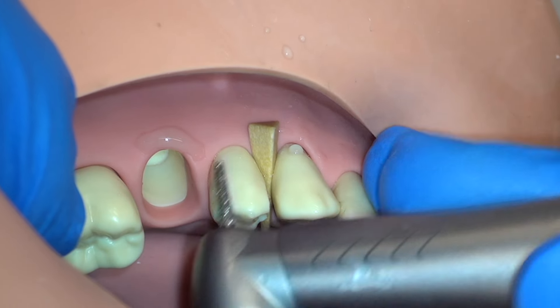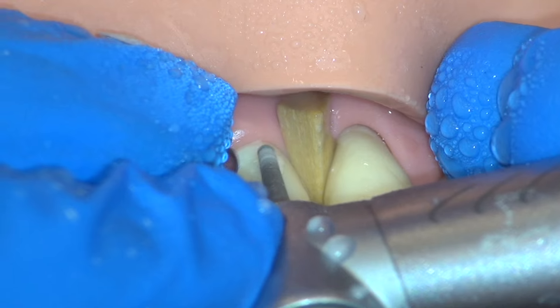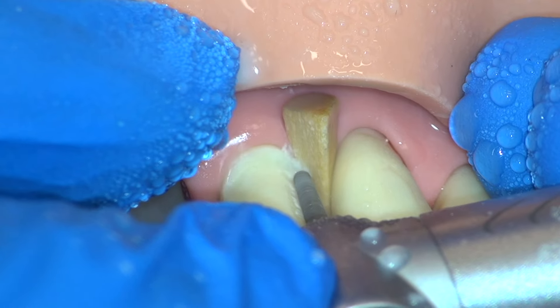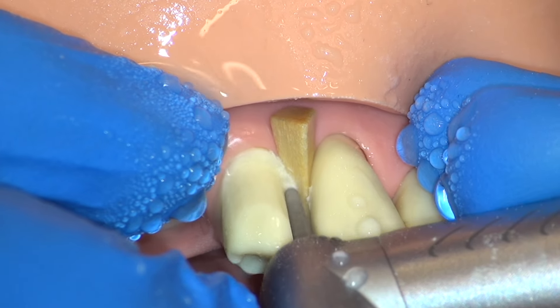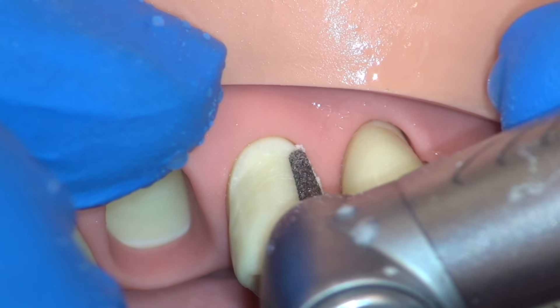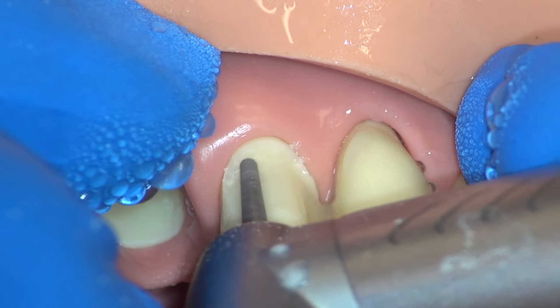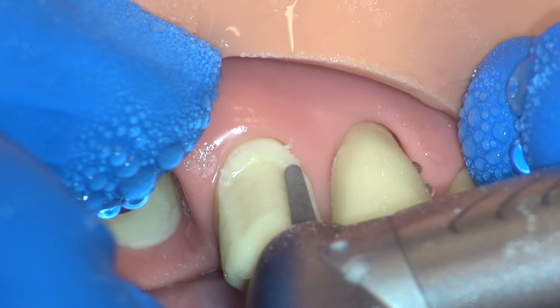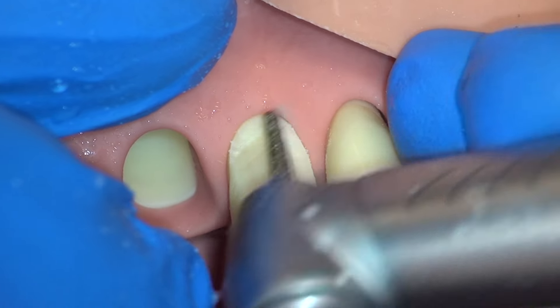Next, I use the green mod shoulder burr to begin the bulk of our reduction for the facial areas of the premolar, which will have porcelain. For these areas, the finish line needs to be a 1.2 millimeter depth, keeping in mind that the tip of the burr is one millimeter. Work sequentially from one side of the tooth to the other in a controlled manner, and bring this reduction through the proximal contact on the mesial, and only to before the proximal contact on the distal. If we did not reach our final depth with the initial cut, we can begin again working across the surface in the same controlled manner. We always attempt to reach our final desired depth on our initial pass so that we do not have to prepare the tooth multiple times.